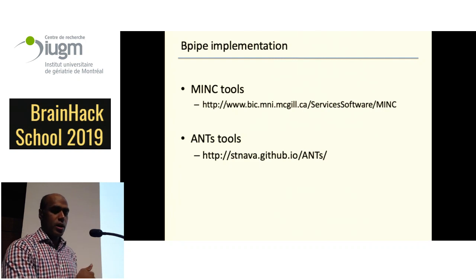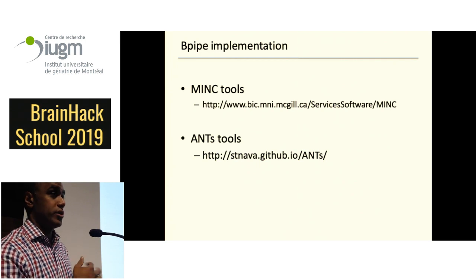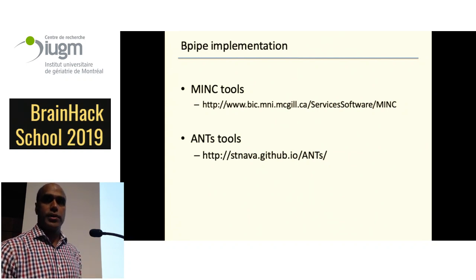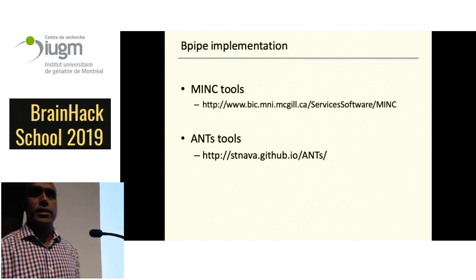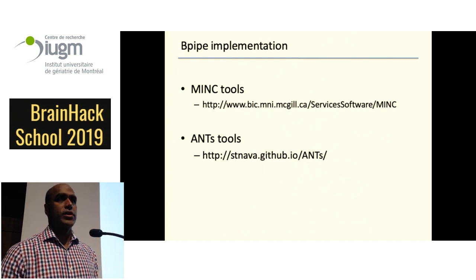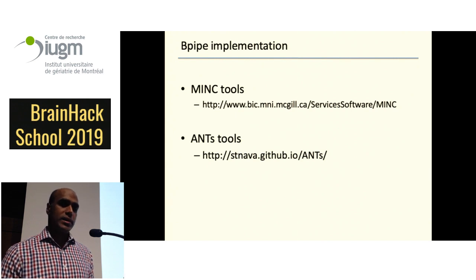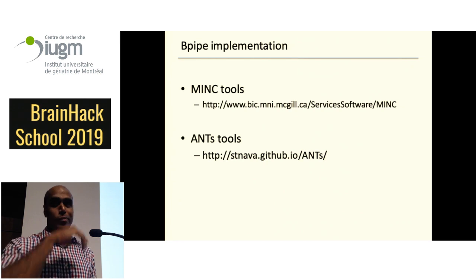So the Bpipe implementation was originally used to work with MINC tools. I have to check in with Gabe Devenyi in my lab, because I think he actually created an implementation that works completely in NIfTI from end to end now as well, which is quite nice for everyone, because not everyone works in the MINC space. And then a lot of the other tools that we use are actually just based on or ripped off of the ANTs group, because we know and like those tools, and we've just adapted them to do the work that we want to do. So there's a couple of things, and basically Bpipe is, at the risk of being self-deflating, a bunch of hacks that we realized work really well when you string them together and try to get your structural pipelines to work.